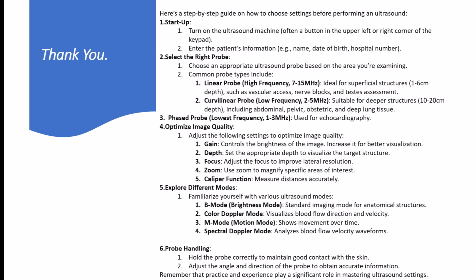We'll end this presentation by doing a step-by-step guide on how to choose settings before performing an ultrasound. First, turn the machine on. Next, select the correct probe. Then optimize your image quality. Explore different modes. And remember that practice and experience play a significant role in mastering ultrasound settings.